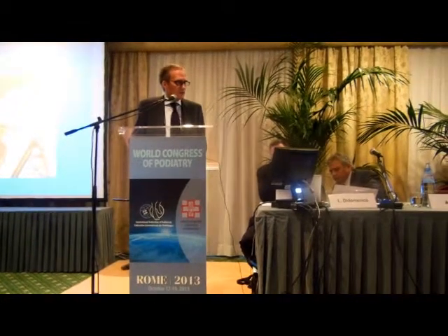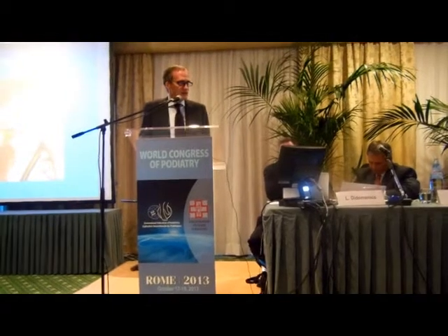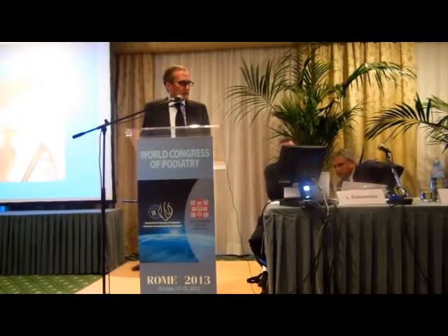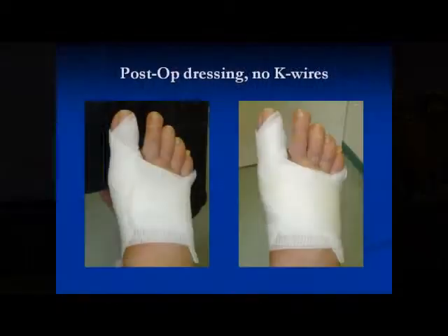And you can use K-wire fixation. Most or many surgeons do not use K-wires. I do because I get a more predictable result. So I use two K-wires. And here's the first K-wire, and here's the second K-wire. As long as you put it in an oblique angle, it'll hold in most cases.